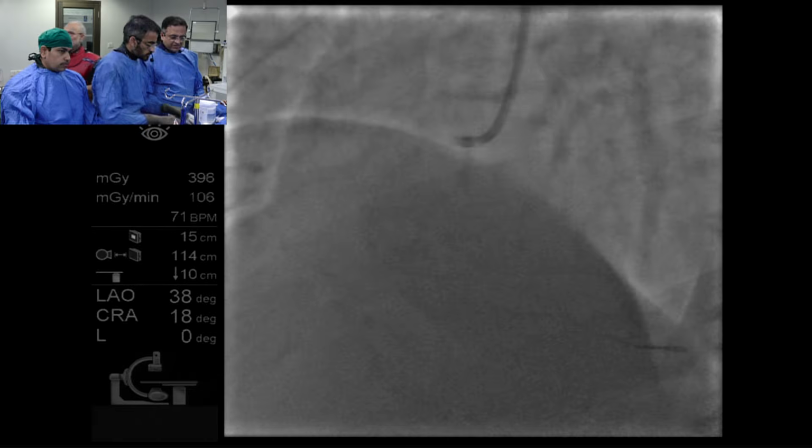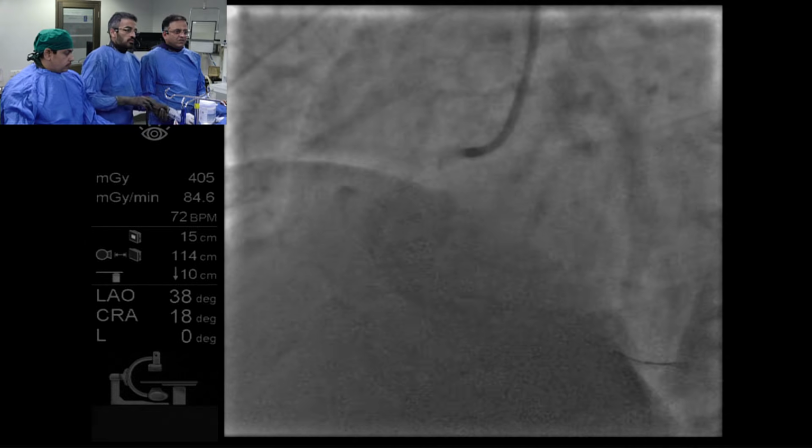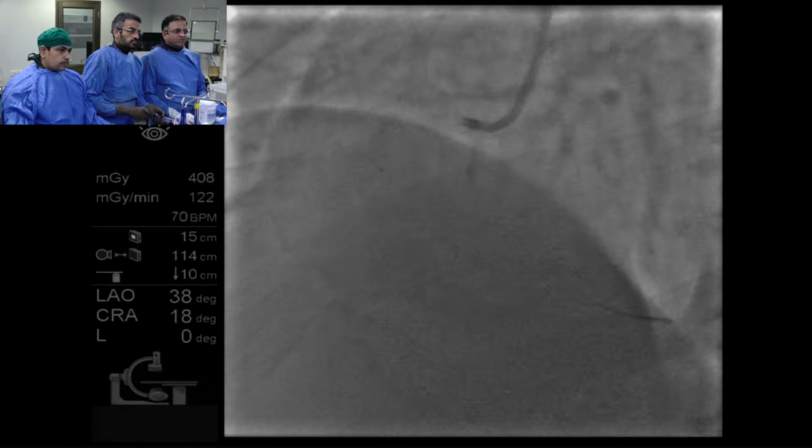Right there. Okay, let's puff. Okay, looks good. Ready? Yeah, go ahead. This must be a slippery spot. Yeah, it's a good spot to start.